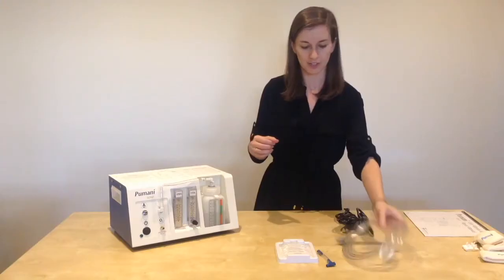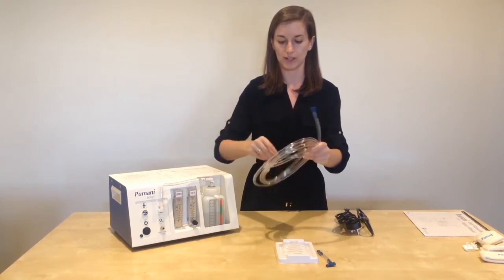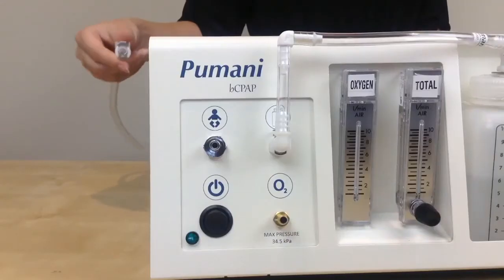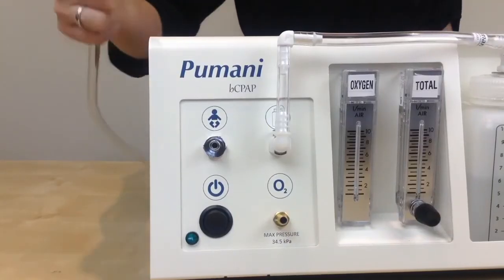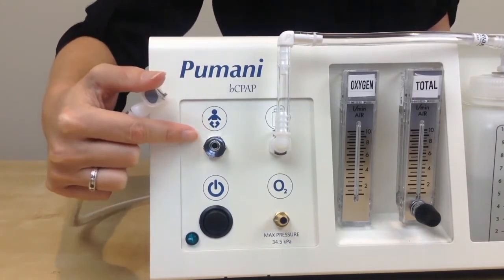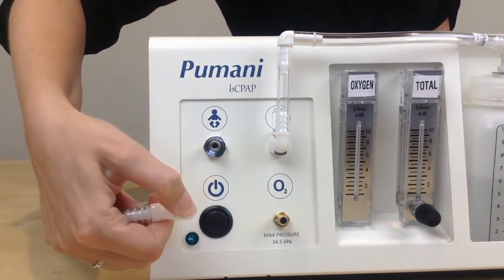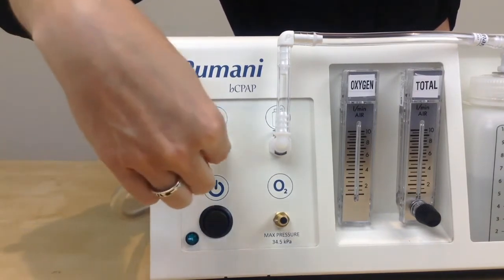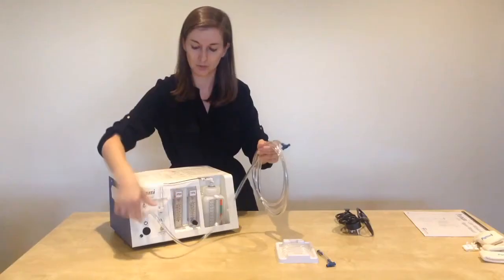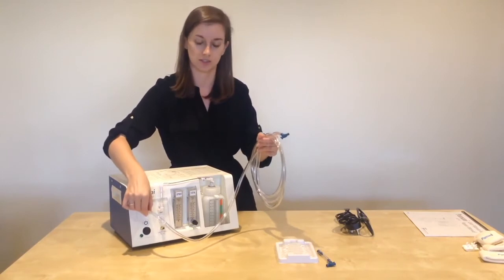Next, take your patient tubing. Take the white end of the tubing that connects to the unit and attach it to the patient tubing port. You may need to press the button and push it onto the port. You will hear a snap when it is attached — you do not need to press hard, it should snap into place.